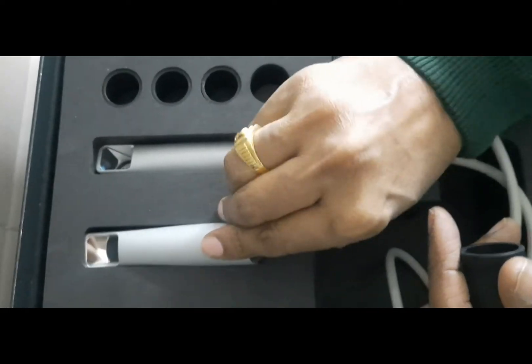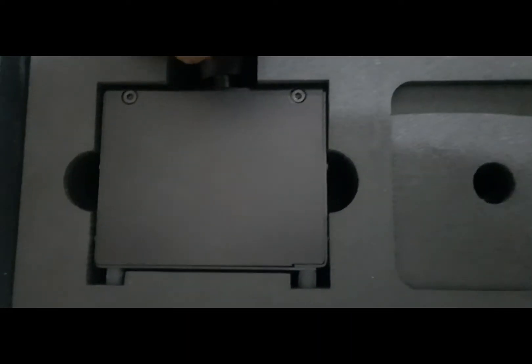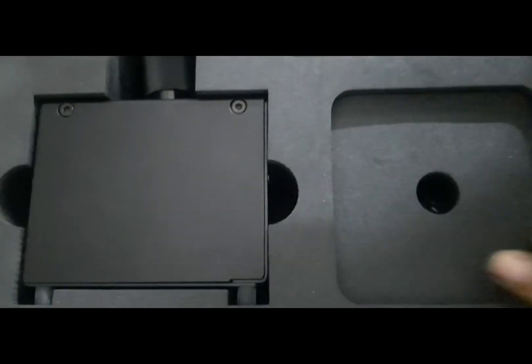Apart from the protective sleeves, you have the sharp adjustment device here. This is the sharp adjustment device, and then you have the cables — these are the various cables for the scanner.